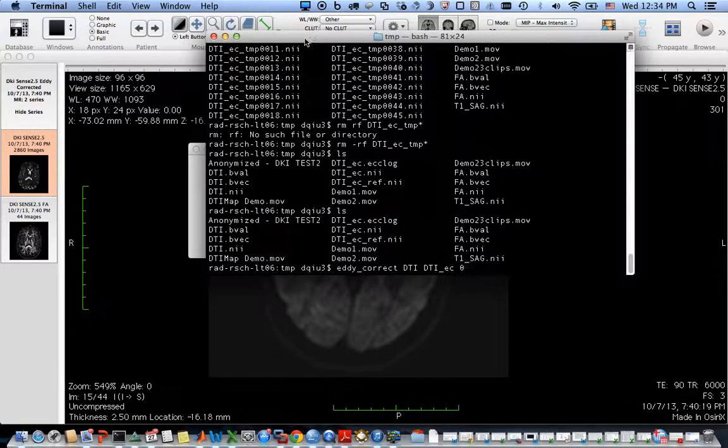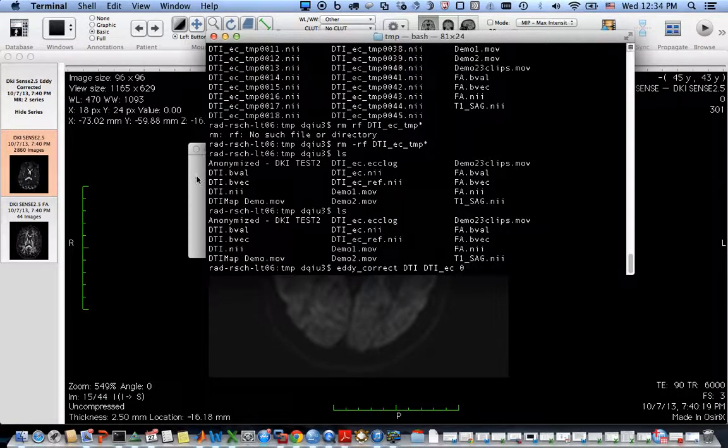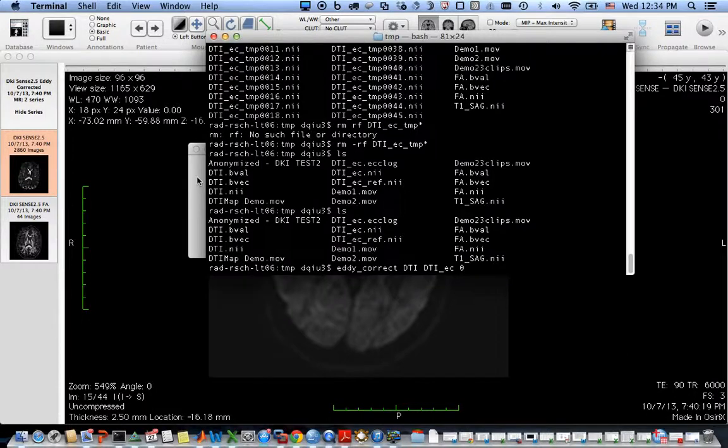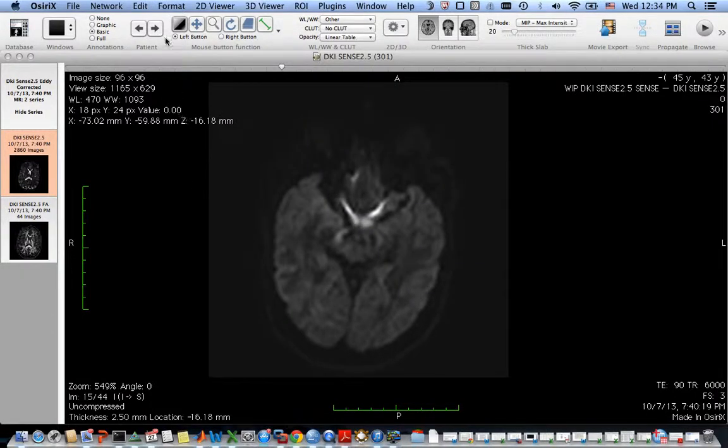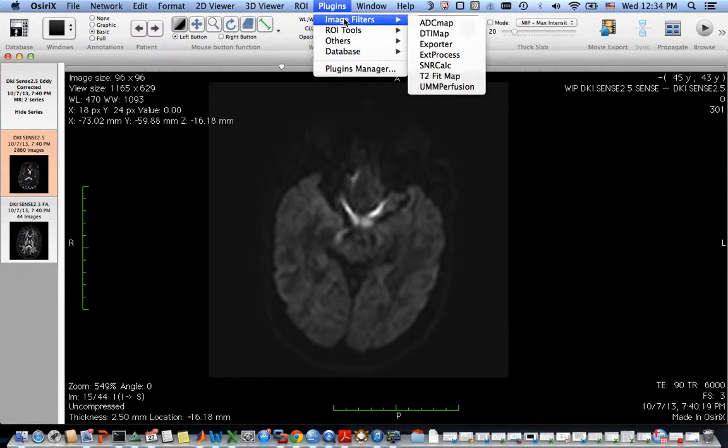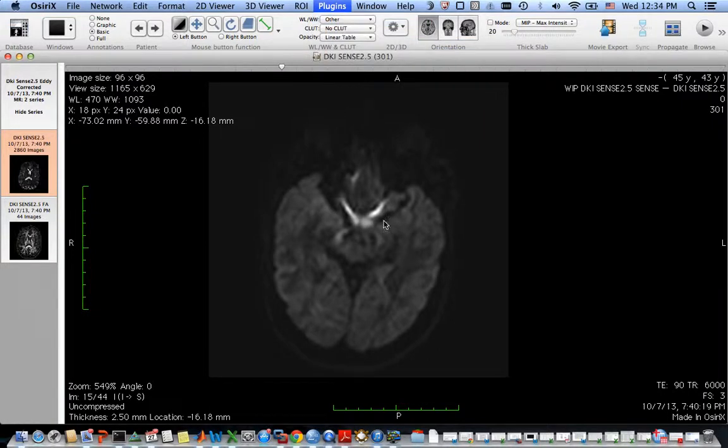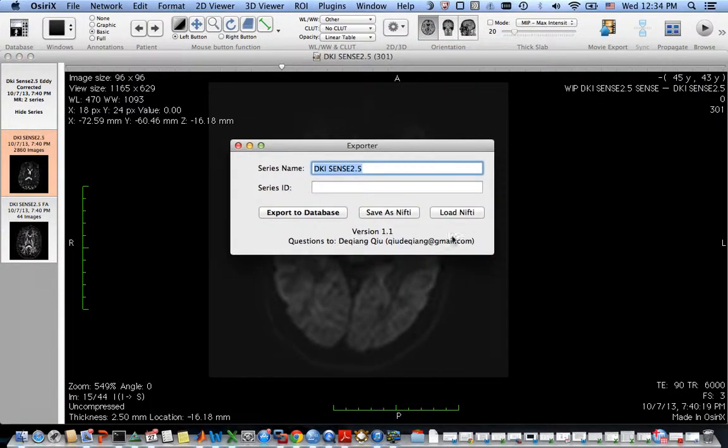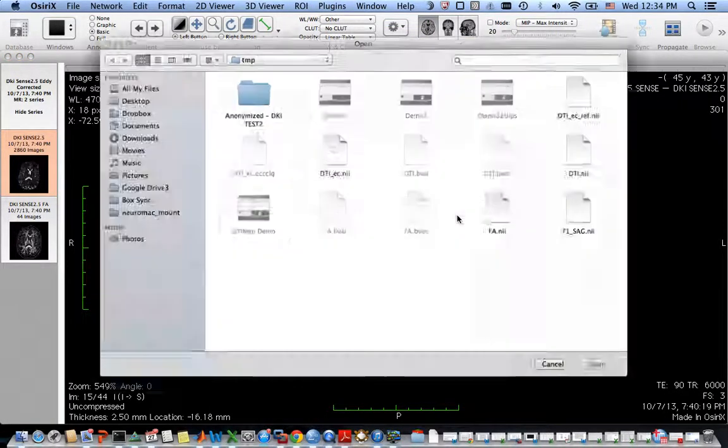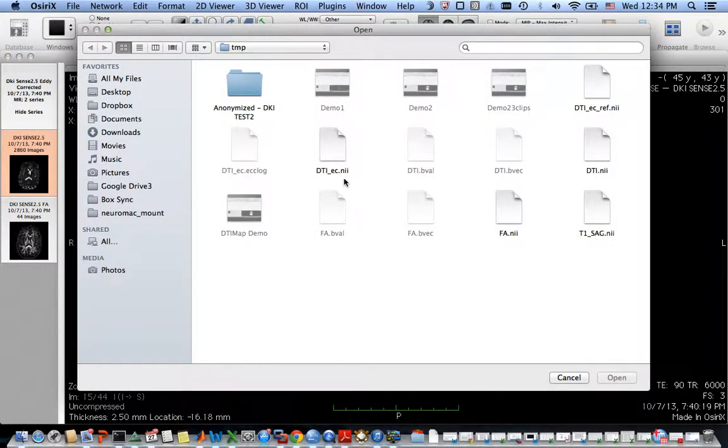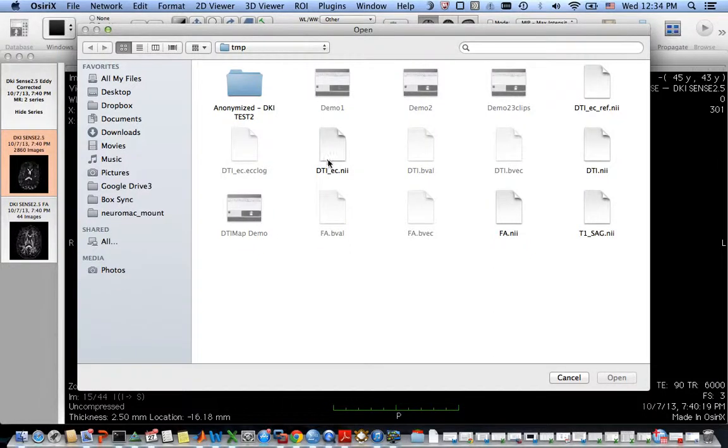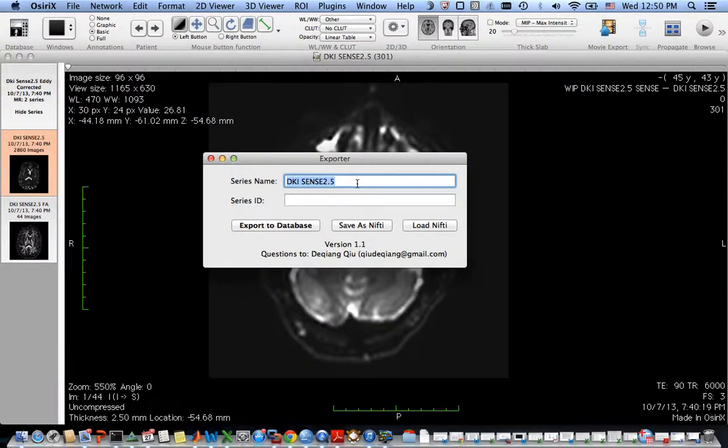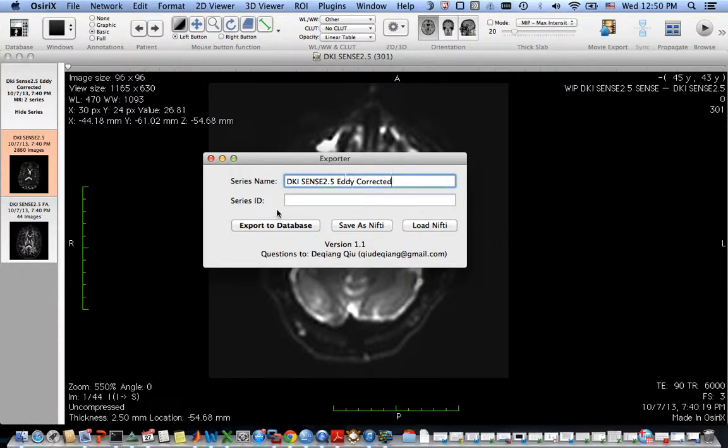Now I want to load the images back to the Osiris database. You want to open the exporter again and load the Nifty file. Give it a different name and then hit export to database.